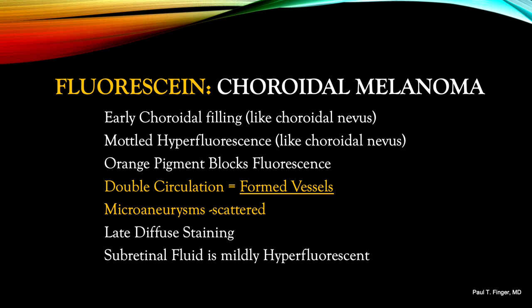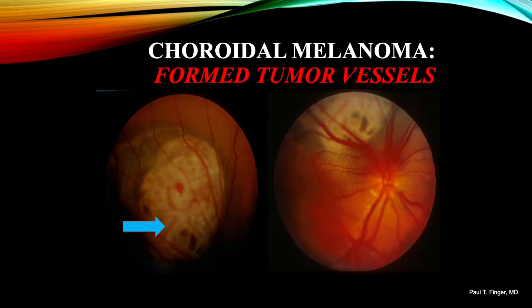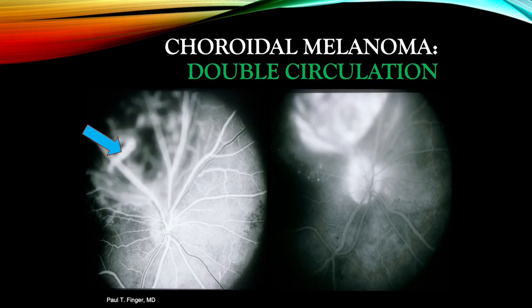Subretinal fluid is typically hyperfluorescent, as seen in the upcoming slides. Note that one of the formed blood vessels is depicted by the blue arrow. This tumor has broken through Bruch's membrane to reveal its vasculature. Formed tumor blood vessels should not be seen in a choroidal nevus, and interestingly, neither in a metastatic choroidal lung or breast cancer. During the early phase angiogram, that same blood vessel is seen to cross beneath the overlying retinal blood vessel — demonstrating the classic double circulation. As seen in the late phase angiogram, diffuse intratumoral fluorescence hides that finding, emphasizing the need to photograph the early phases of the study.